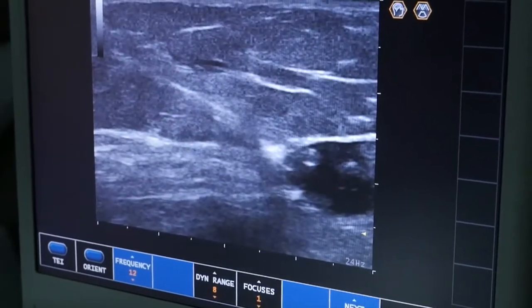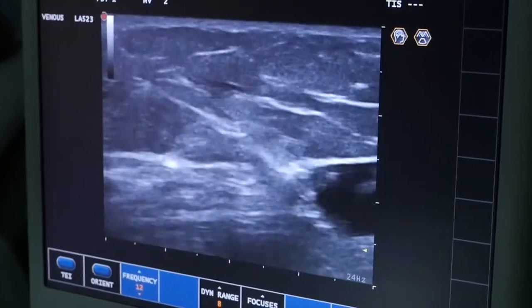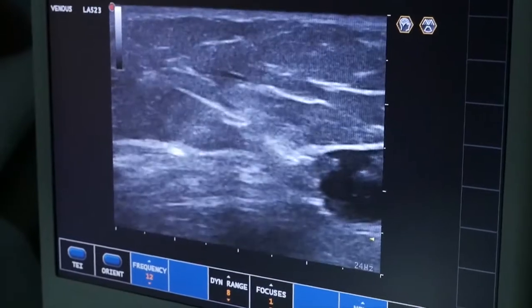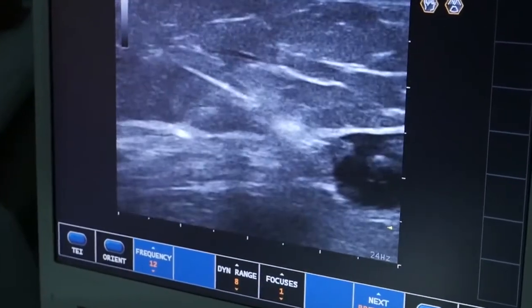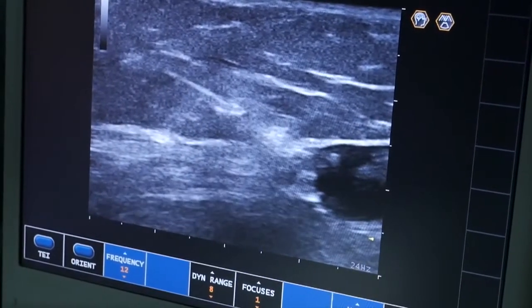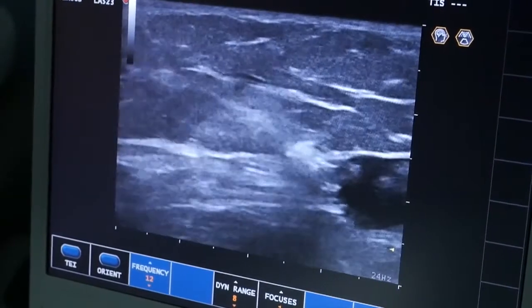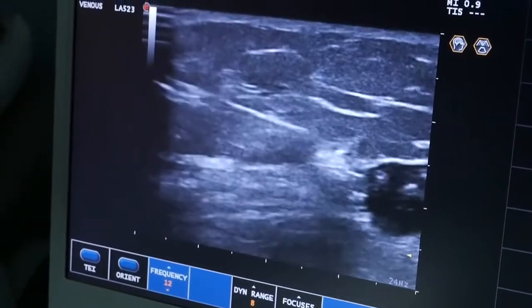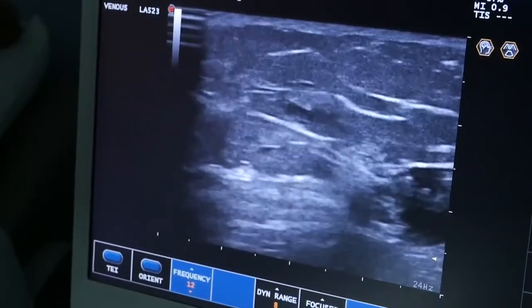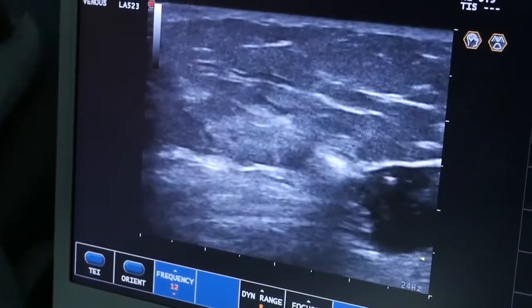So now the tumescent is in, and we're beginning to use our energy source, and you can see the cavitation there where the perforator is being destroyed by the energy source. And we'll basically tap the foot pedal several times until we've had between 9 and 11 seconds of energy, and usually between 70 and 95 joules of energy in order to close the perforator vein.